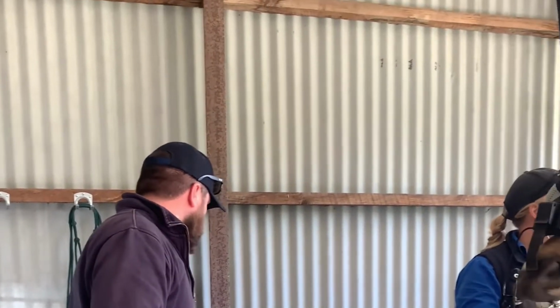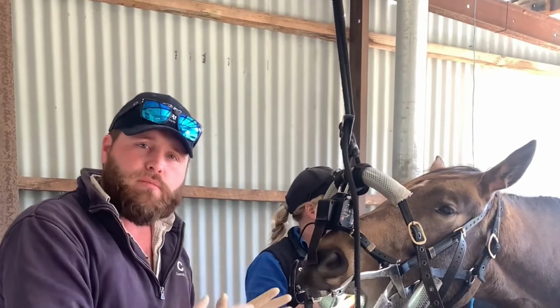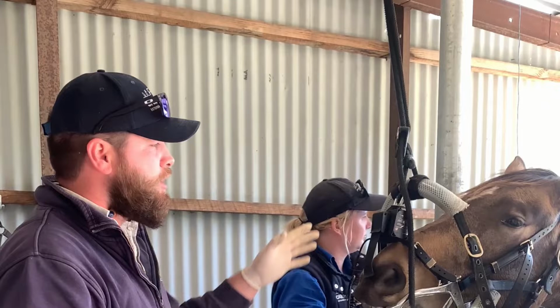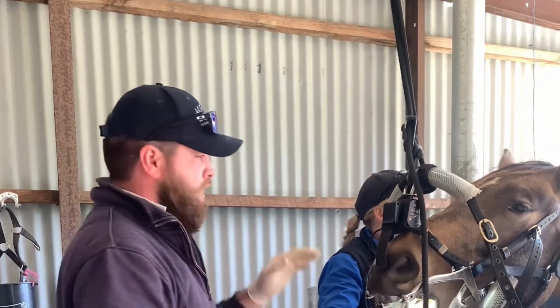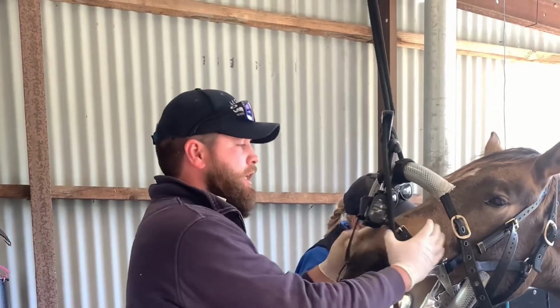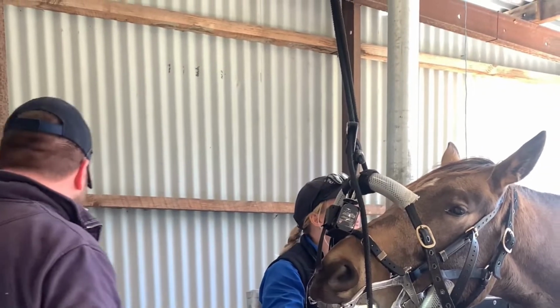It provides that ability to do a good, thorough job and get those tools right at the back where we often miss points. We regularly see, going out, a horse that has recently been floated and still has the same problems, and it's because the backs haven't been achieved. You can't get right the way back there if you're not looking from back here and you're only getting the front first three premolars. You often miss the back molars. So these tools give us that ability.